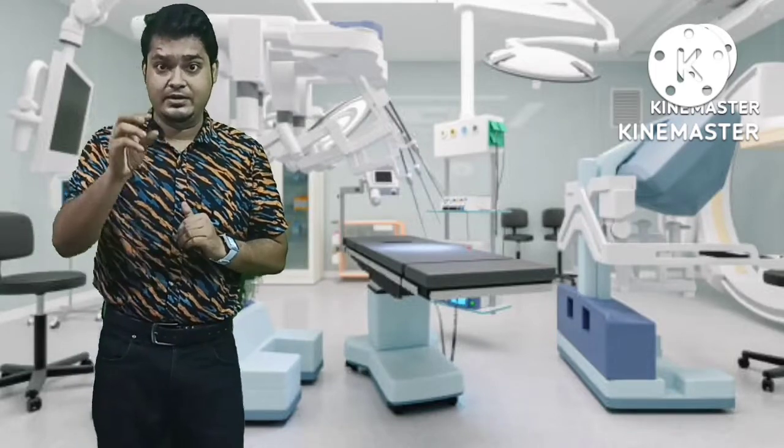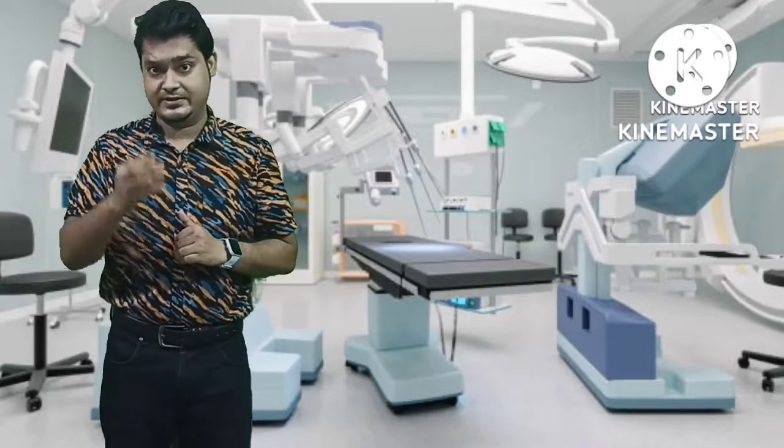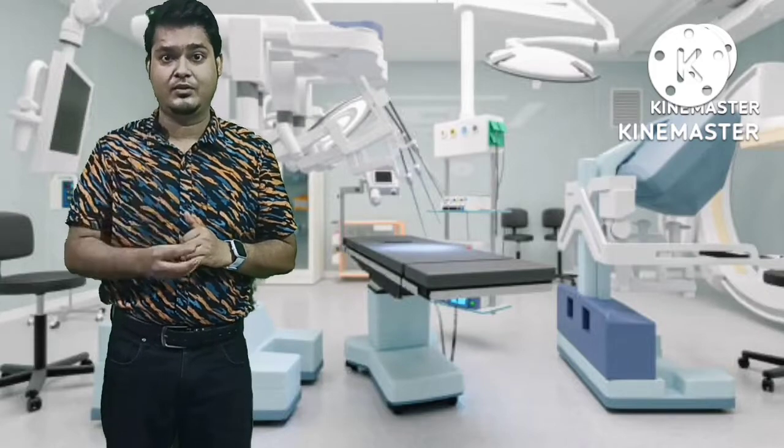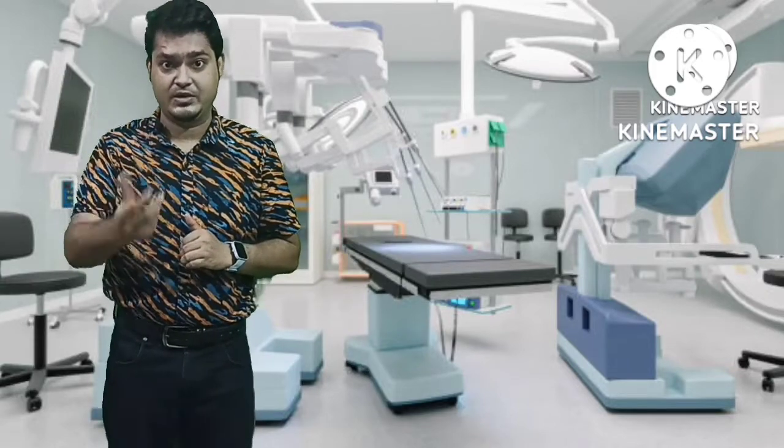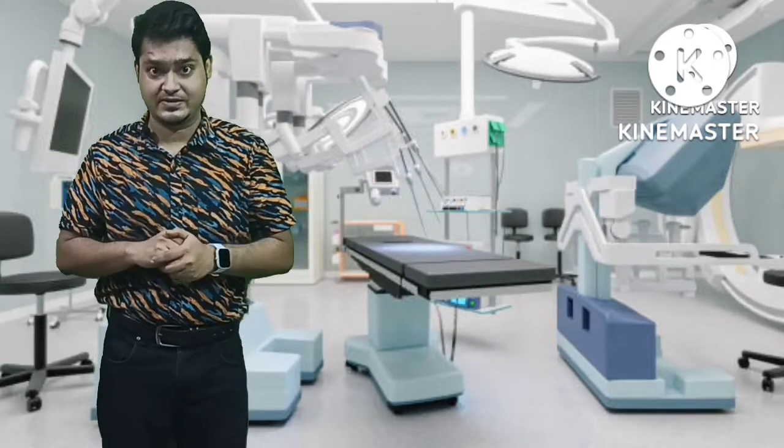Okay, and what angiography is all about is also important to know. Angiography is basically the examination of the arteries with the help of contrast media administration to delineate all the arteries of the heart that supply the heart muscles.